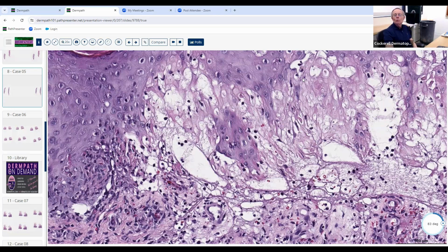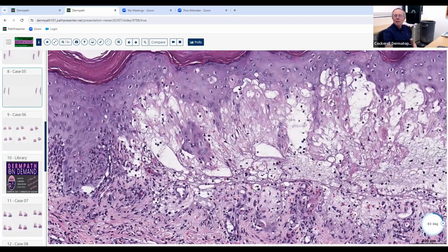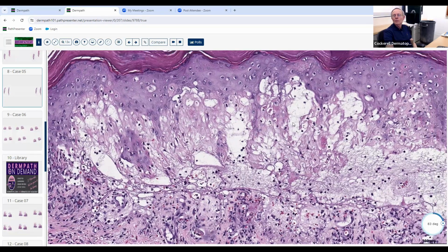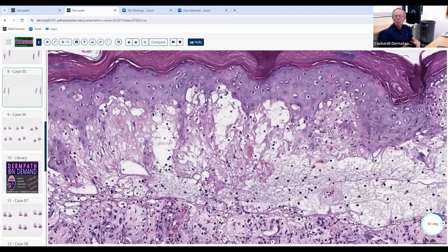And we call that reticular alteration. Reticular meaning kind of reticulated, like a net, if you will, strings, if you will. And that's actually characteristic when we see ballooning degeneration with papillary dermal edema. But it's often seen with ballooning degeneration. So it suggests to us that something is going on both in the epidermis and in the dermis, in the papillary dermis, when we get this. So it's kind of a combination of papillary dermal edema plus edema of the individual keratinocytes.